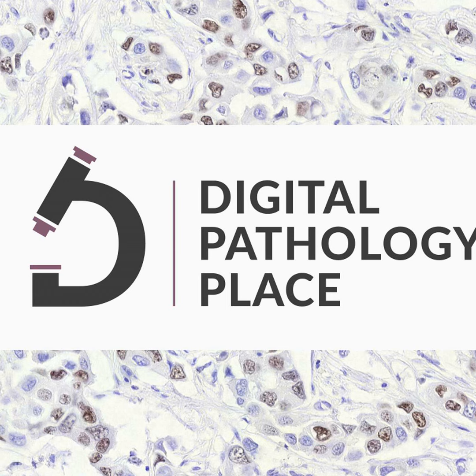So like you mentioned, cytology is a sampling modality that veterinarians can perform in their clinic. So they take an aspirate, a needle biopsy essentially, into a mass or a lesion of some sort, and then they can spray the cells onto the slide and stain it right there in their clinic and look at it under their microscope.